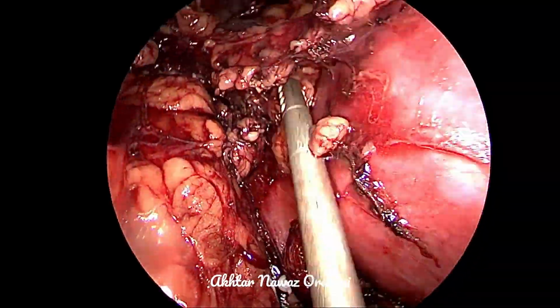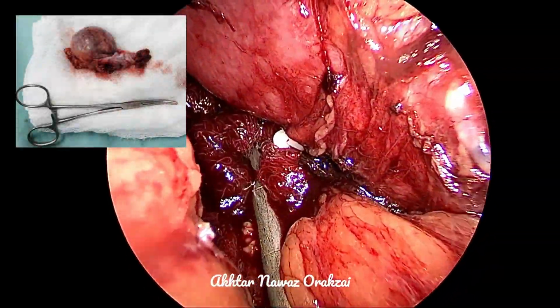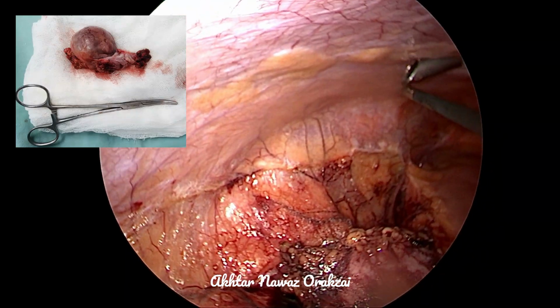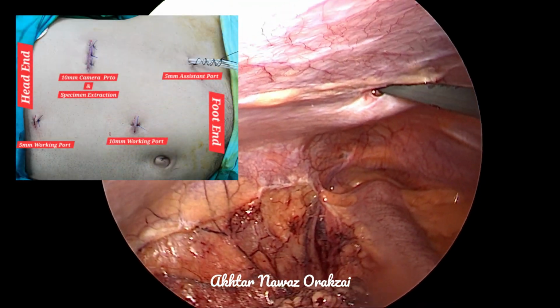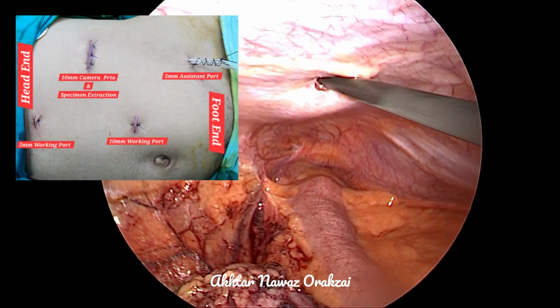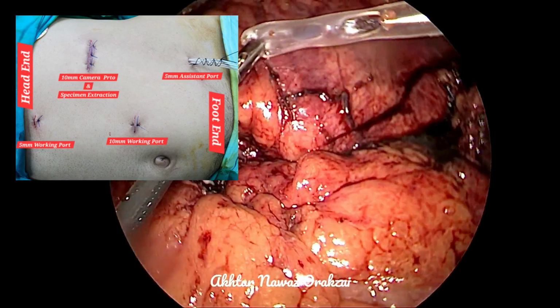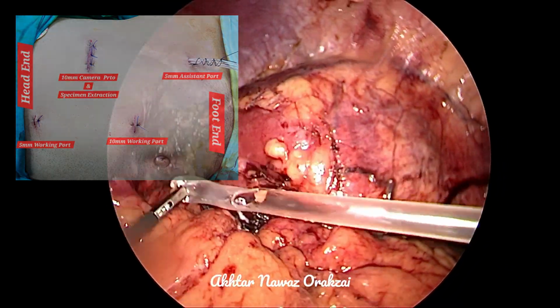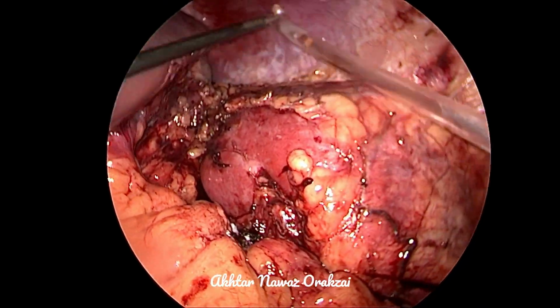And after doing a little bit of cleaning, we place a drain through the assistant port, and the specimen would be retracted and extracted through the camera port.